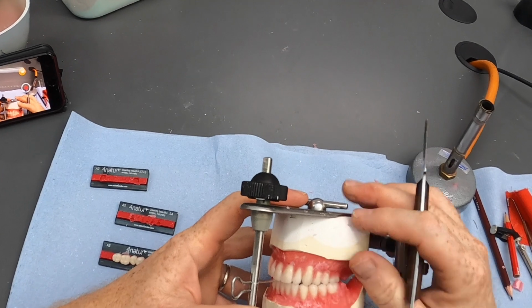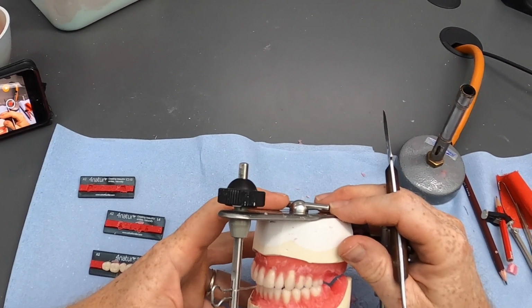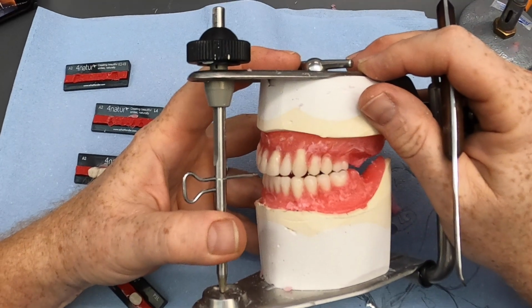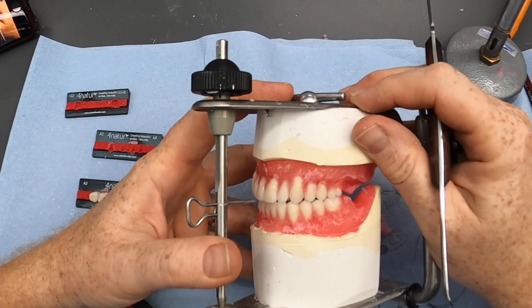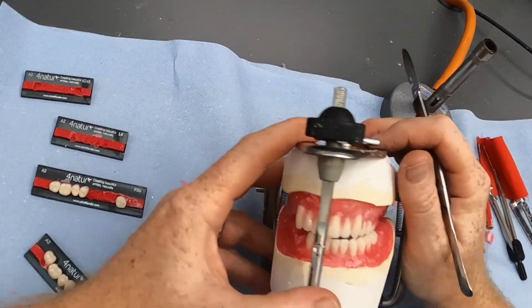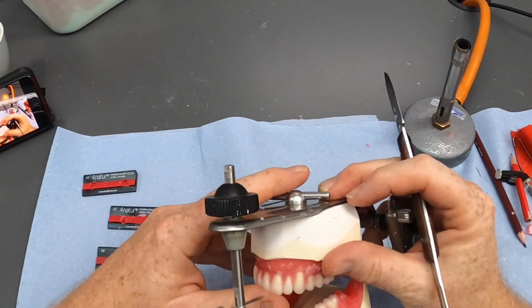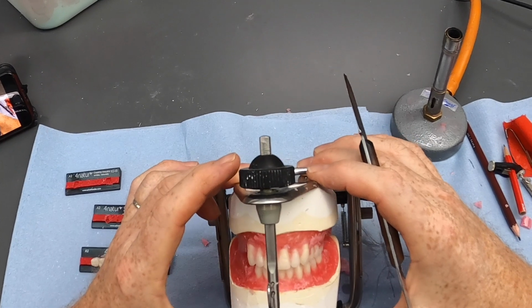You can see my canine is just causing the denture to tip. Look, can you see? The two canines are just contacting. And when I go, you can just see the top denture starting to displace off the model. Yeah. This shows you why we need that balanced occlusion. I think it's the canine anyway. Yeah, it is. There's nothing on the other side. I might just whiz that off in a sec, and we'll see if we get something a little bit better.